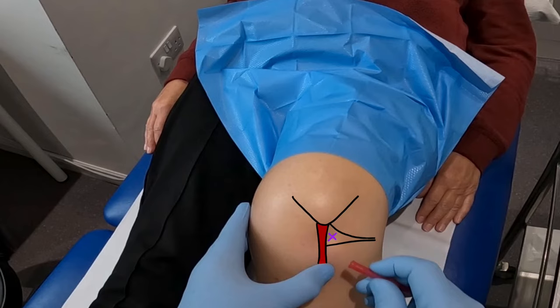To find the anteromedial site, the same process is mirrored on the medial side of the knee.